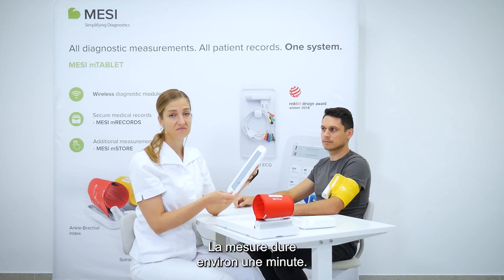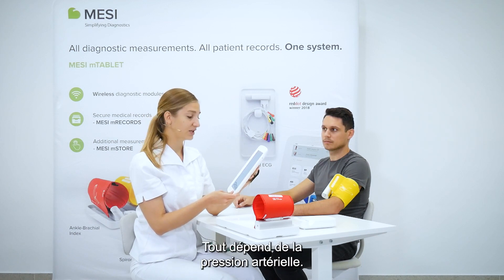The measurement takes about a minute or so; it all depends on the patient's blood pressure.